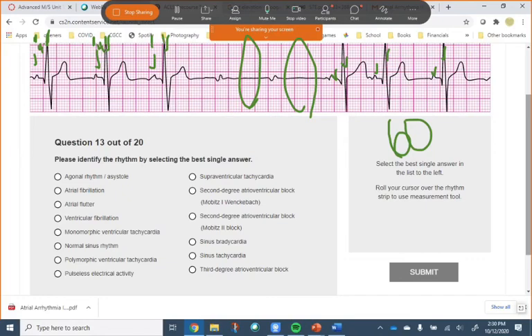One, 2, 3, 4. That one's 5. This one's missing. This one's missing. It's hard to tell where this piece starts. 1, 2, 3, 4, 5. 1, 2, 3, 4. This is 5. So they're basically exactly the same, except you have dropouts.